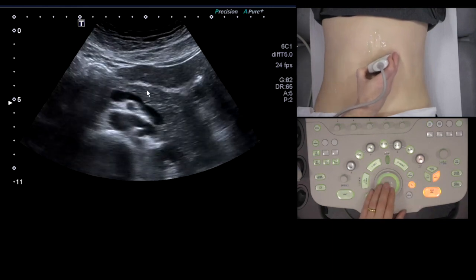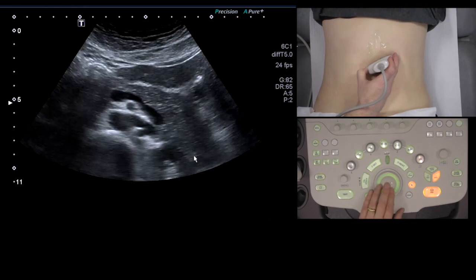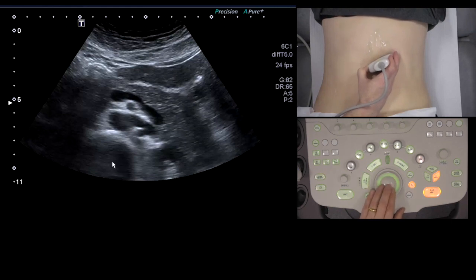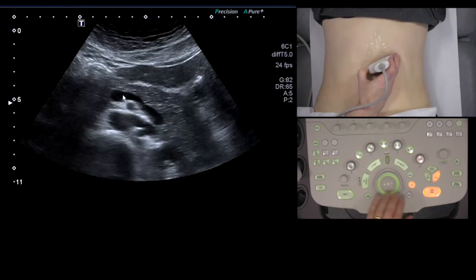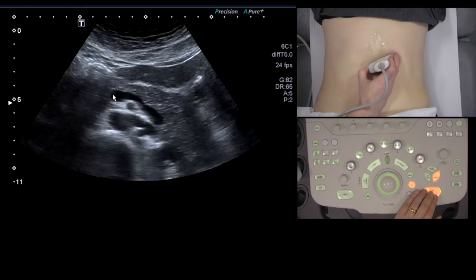So with this frozen image, this is the tail of the pancreas, that's the spine, that's the abdominal aorta, SMA, and the splenic vein coming up to the portal confluence there.